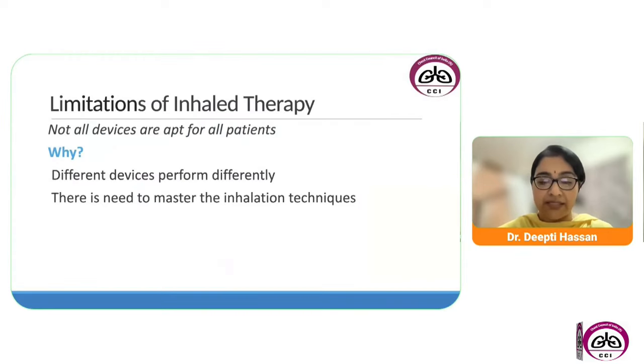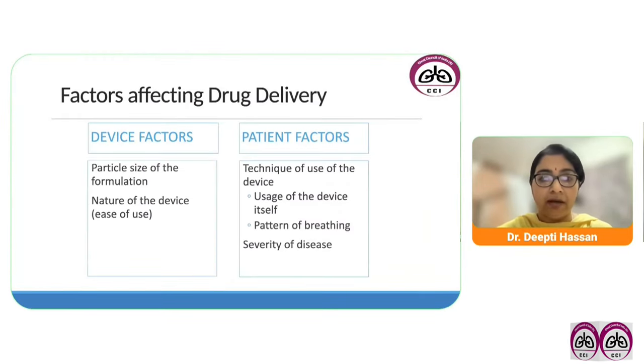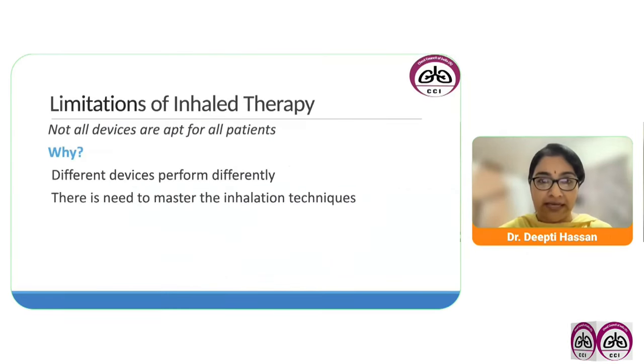So what are the factors that actually affect drug delivery? So apart from the particle size of the formulation, which we have already discussed, it is the nature of the device, the technique of use. That is, the patient should know how to use the device, and also the pattern of breathing, which is important, which differs for each device, we'll be discussing in the coming slides.